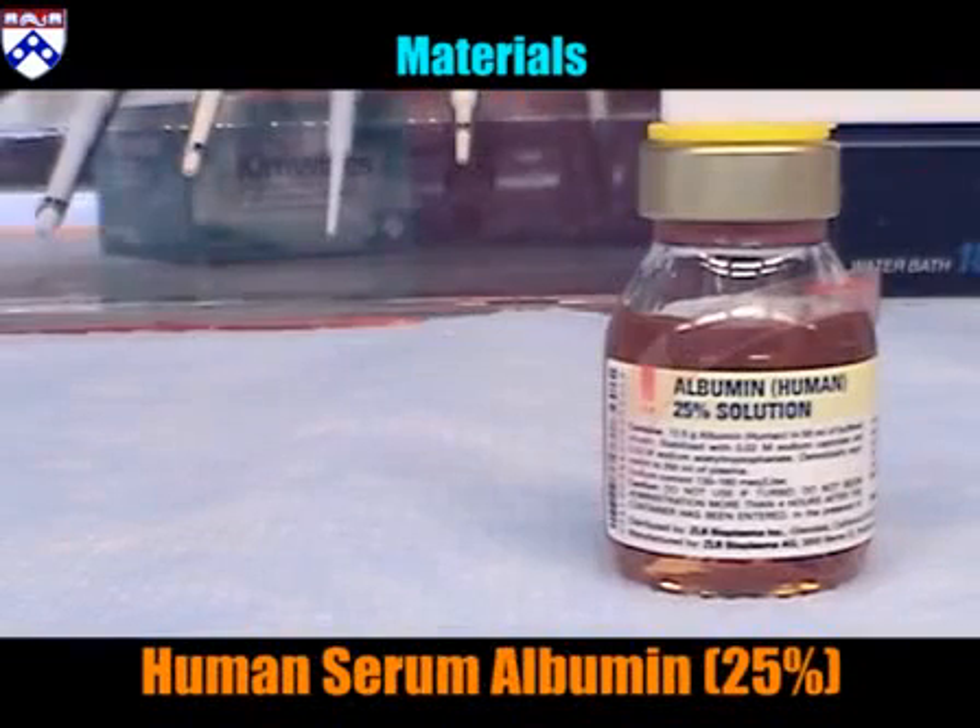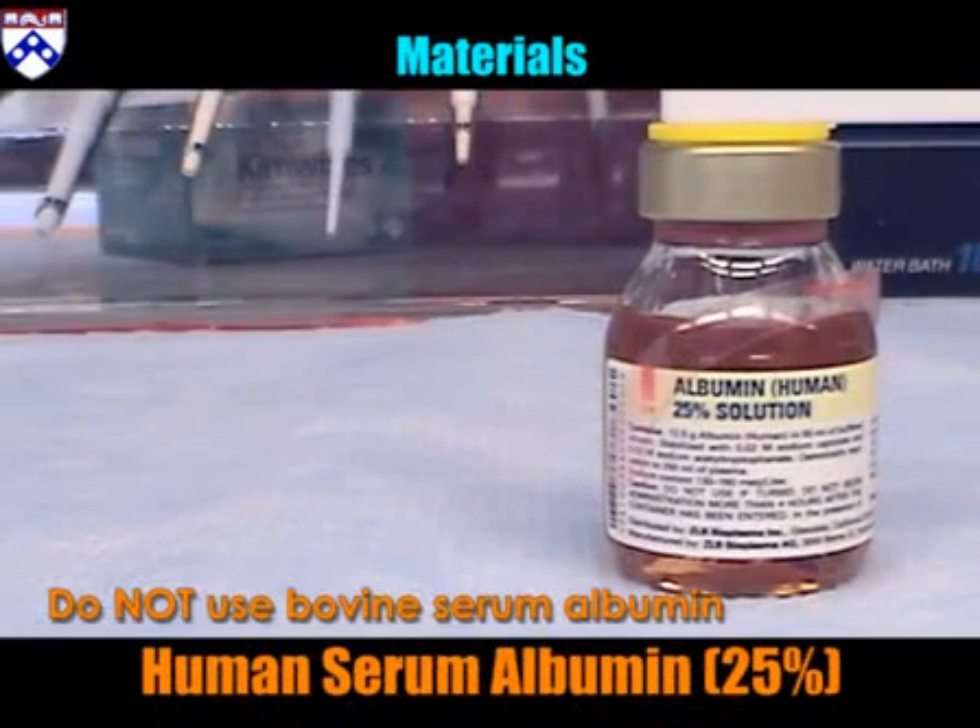Human serum albumin, or HSA, is a protein in the blood plasma that maintains pH and osmotic pressure. Do not use bovine serum albumin.